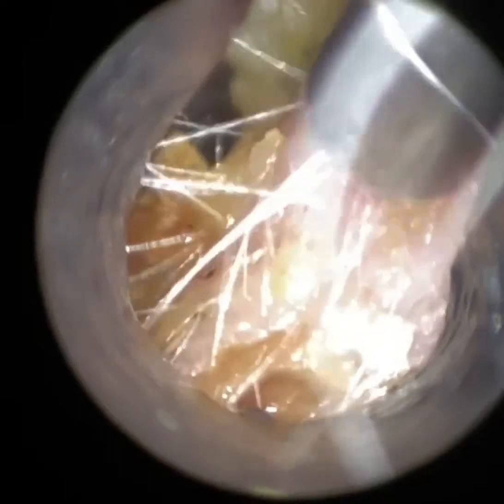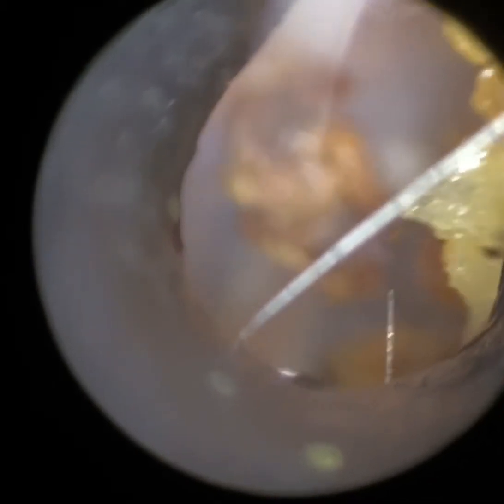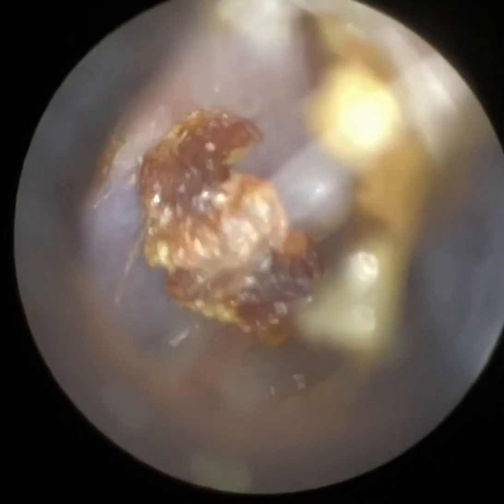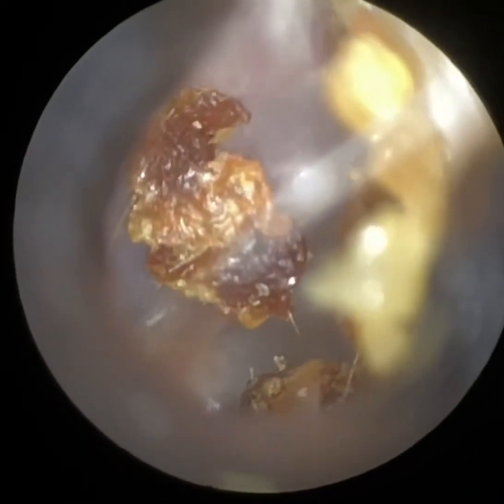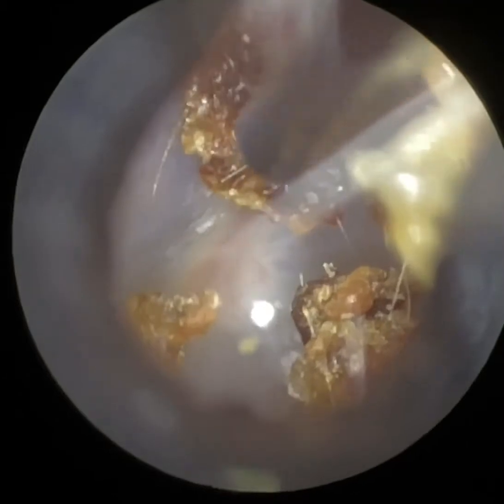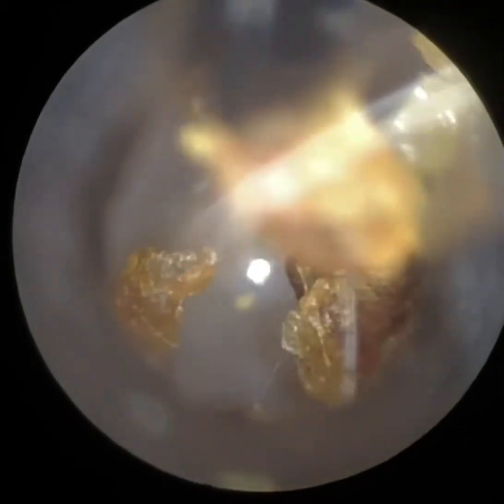You can see we're bringing this slowly outwards, and we're just mopping up some of this debris near the entrance. This patient's entrance of the ear canal is slightly narrowed, and if you're using an endoscope you would need to use the endoscope to stretch the ear. You can see here we're just dilating the ear and I'm getting this dry wax and keratin in focus — and actually some of it is on the patient's eardrum. We've just stretched the ear open, dilated it with the speculum. I've just got that piece of keratin on the eardrum in focus. I'm now using a fine-end suction probe, entering the ear, hovering over it. It actually removed some keratin that was not in view with the suction probe there.